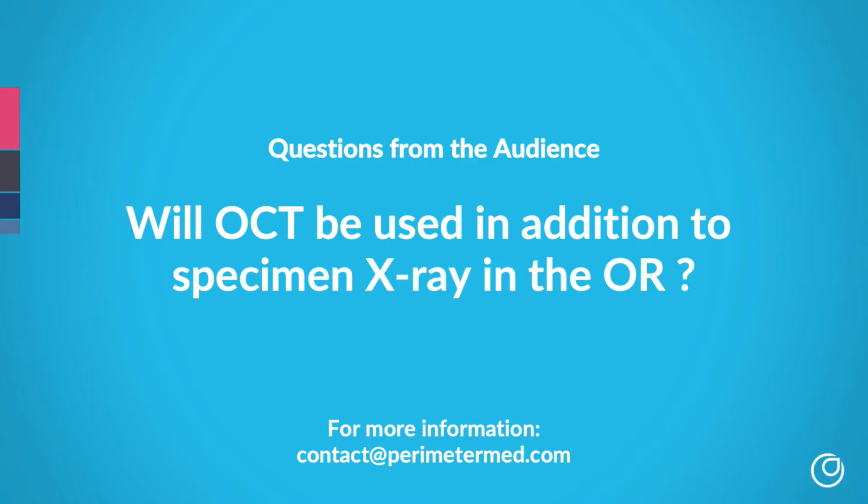So this is about using everything that we have. We have the pathology, so we know whether it's DCIS, high grade, multifocal. We've got the MRI images. And then you have what you use in the operating room. And I typically do ultrasound localizations unless I'm bracketing calcifications where I use the RFIDs.